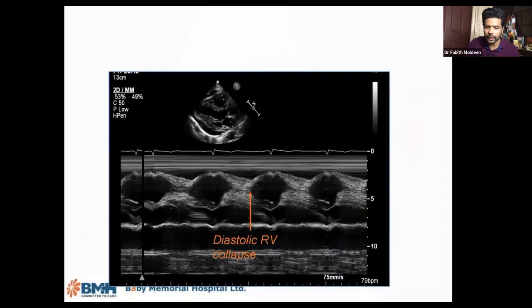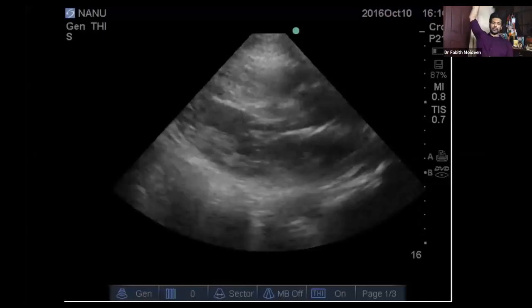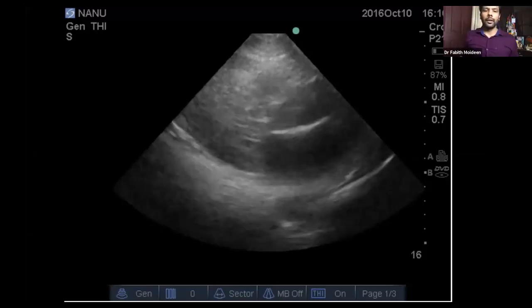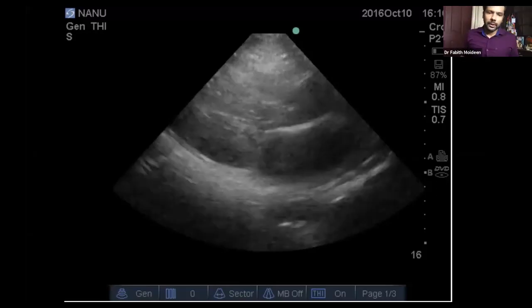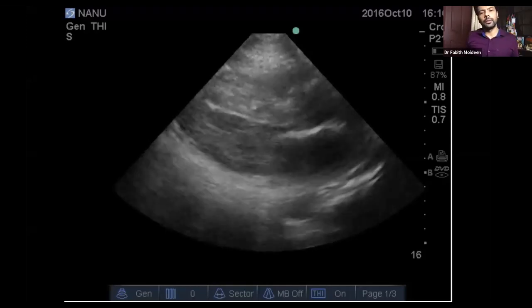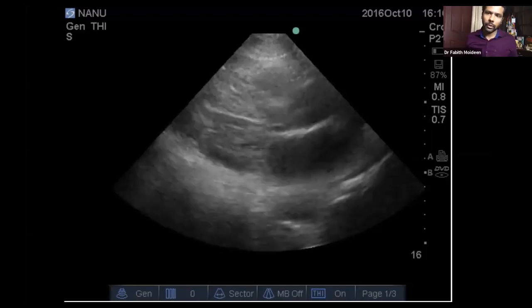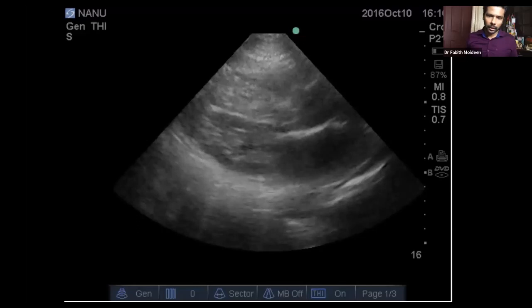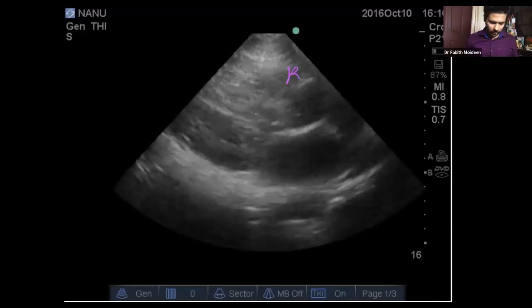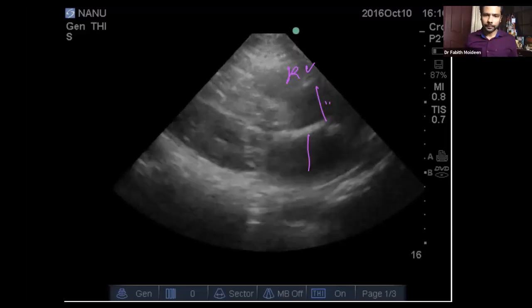Okay, this is important. Anybody? I think it's the last one. I want an answer for this. We'll give 1 minute. Start from outside to inside. Identify this as a parasternal long axis. Good. Any fluid around the heart? No. Right. Rule of 3. So here you have the RV, the aorta, and the LA. All looks okay.